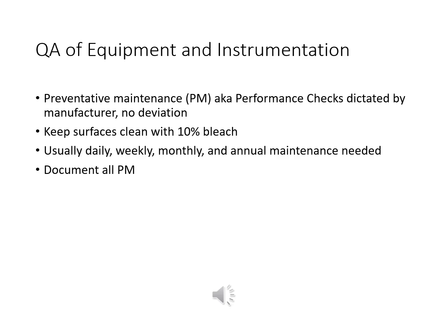Make sure, like we mentioned earlier, that you're doing your maintenance as needed. If it's daily, weekly, monthly, biannually, annually, whatever it is, make sure you're doing it. And then also make sure you're documenting that you're doing it. We like to say in the lab, if you didn't document, you didn't do it. So make sure you document everything, really.